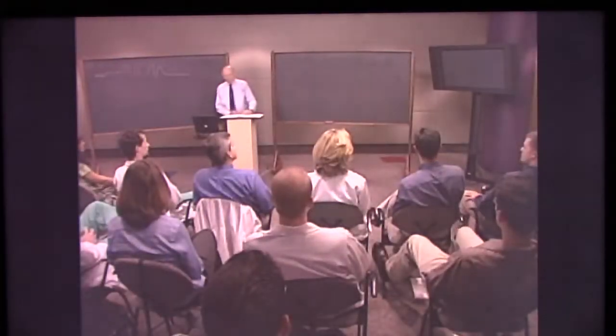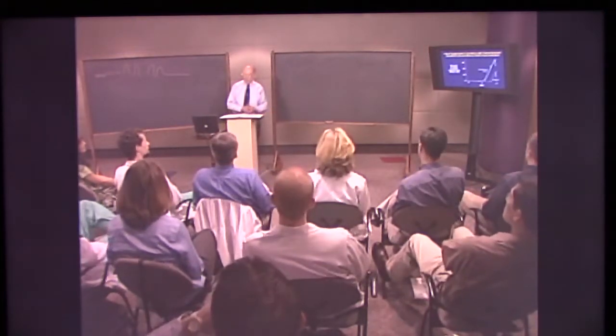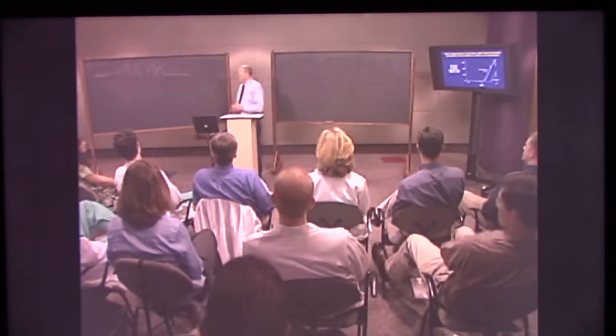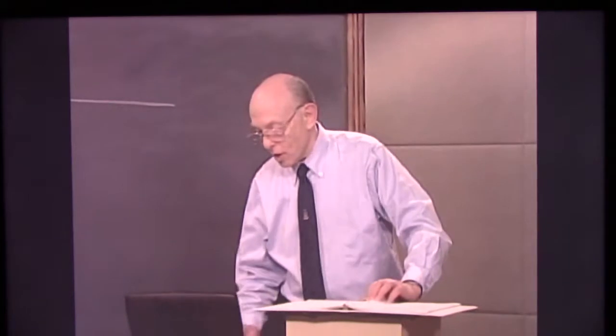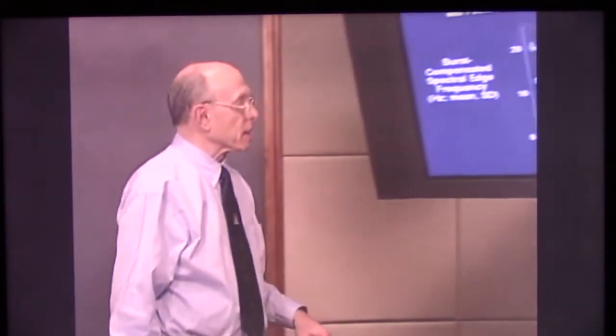Exactly correct. And in addition, we can look at the amount of energy that's in the EEG. The amount of energy at certain frequencies can be looked at in terms of the spectral edge frequency. That is, we can look at the edge as the highest frequency at which we find activity, either 95% of the activity or 100% of the activity.